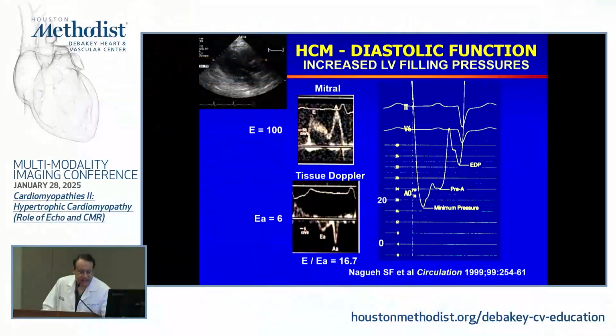Diastolic function assessment, echocardiography is really the main tool that is used. One can get filling rates. Sometimes you can get mitral inflow velocities and even annular velocities by CMR and CT, but they have lower resolution and probably wider confidence intervals in the measurements that you get from them.